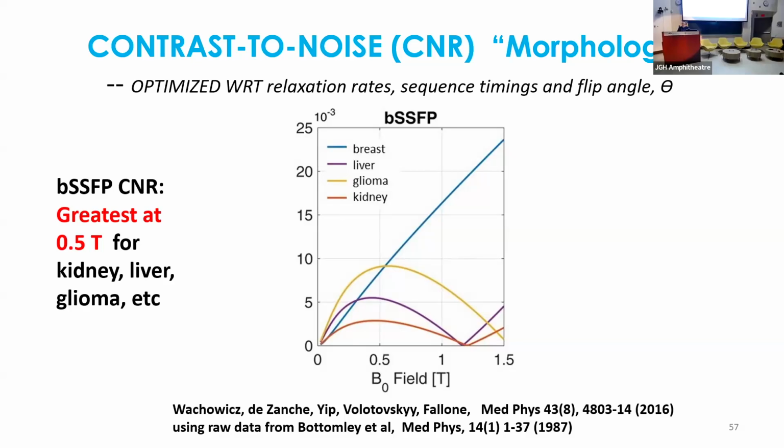If you use a megavoltage image, in other words, instead of using an X-ray tube, you use a linac to take the same picture, there's no noise, but you don't see anything, literally. There are all sorts of reasons why, but you see bugger all, to use the expression. That's why you do lung at diagnostic, not at therapy, because you don't see it. In that case, the contrast is really low, even though the noise is also low. Same in MRI.